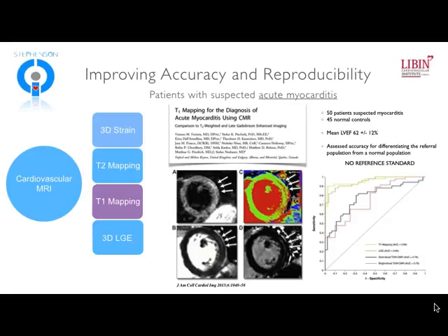And they were assessed for really the ability of T1 mapping to identify or be congruent between people with or without suspected myocarditis. And this is important to delineate, that there really was no reference standard in this study. It was really looking at the capacity of an imaging variable to place somebody in the referral population or in the control population. That was their outcome measure. It really was not against any reference standard.